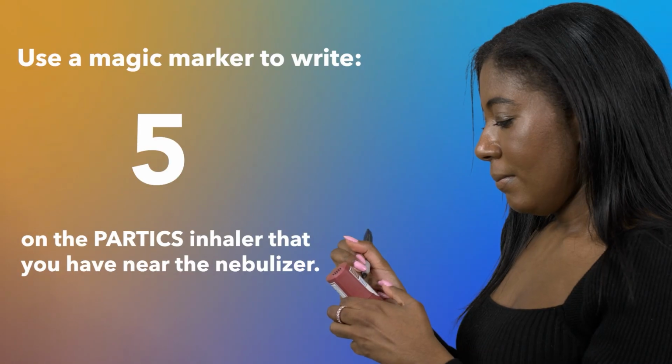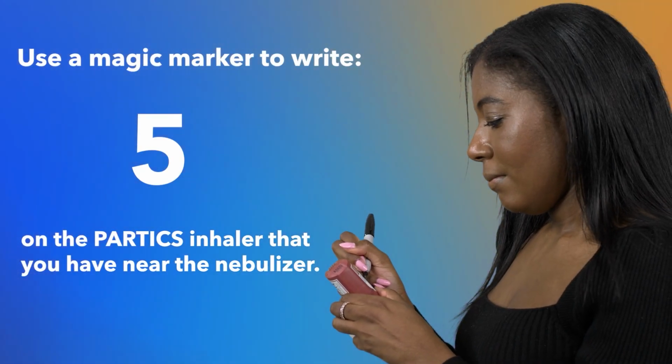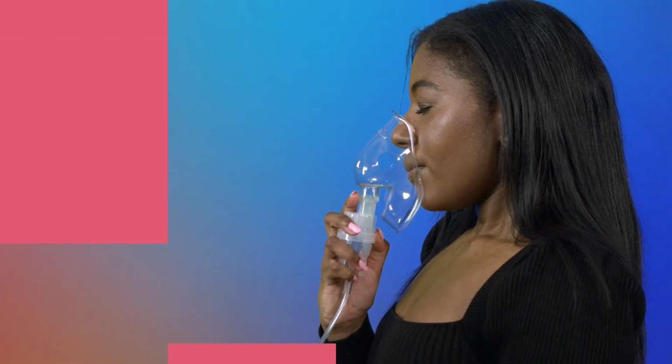You may want to use a magic marker to write 5 on the PARTICS rescue inhaler that you keep near the nebulizer to remember to take 5 puffs after you have finished your nebulizer treatment. Inhale each puff and hold for 5 seconds.